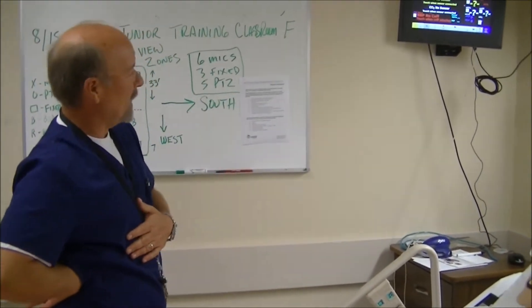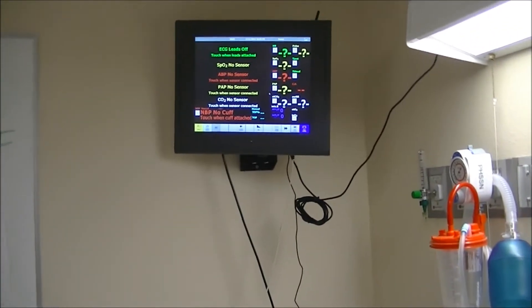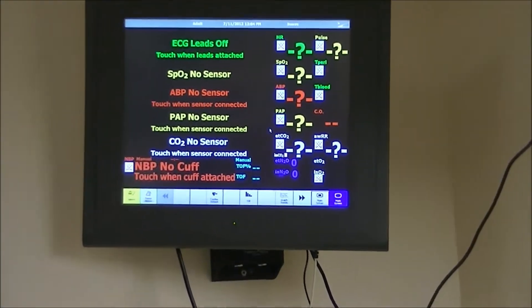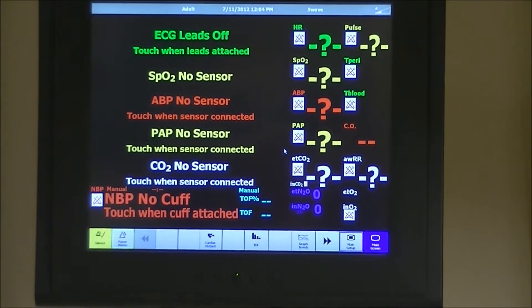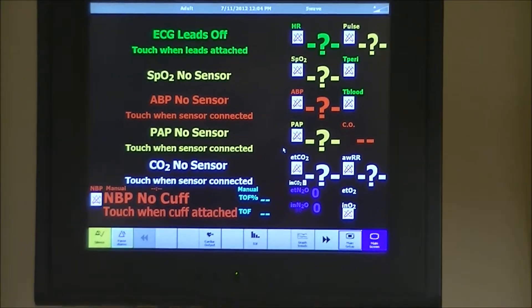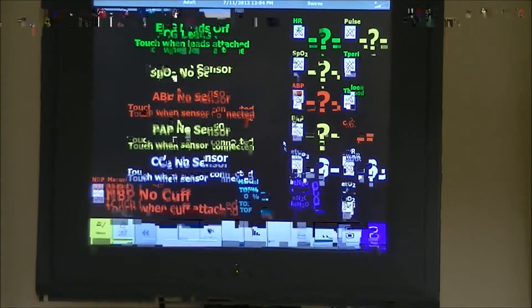First thing we're going to look at is the monitor — our patient monitor on Fred. As we talked about last time, Fred is essentially autonomous and wireless. His monitor is not physically connected to him, so it's wireless. He generates his own Wi-Fi. We're going to look at Fred's wireless monitor up here.